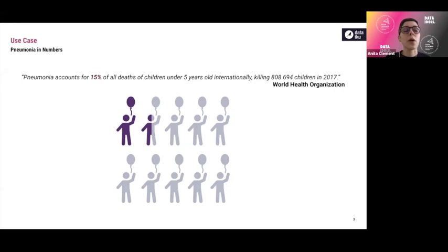But even the review of the radiographs themselves can be quite difficult, because there are a high number of different parameters that could alter the radiographs, for example the presence of other conditions in the lungs, such as bleeding or cancer, or even just the positioning of the patient or depth of respiration.